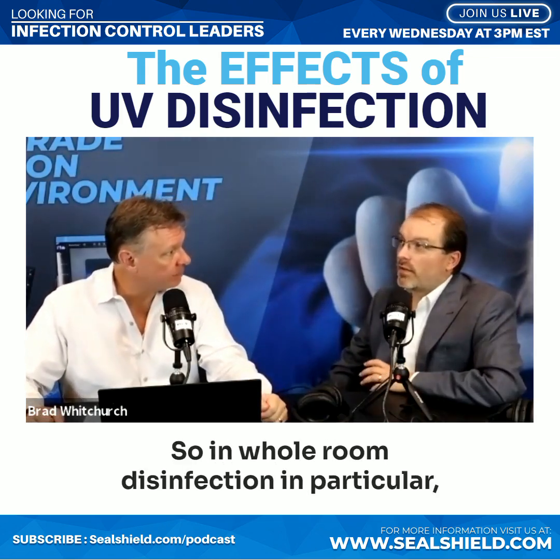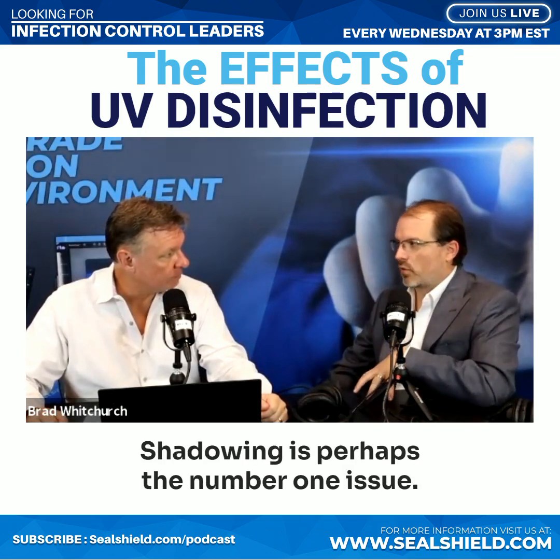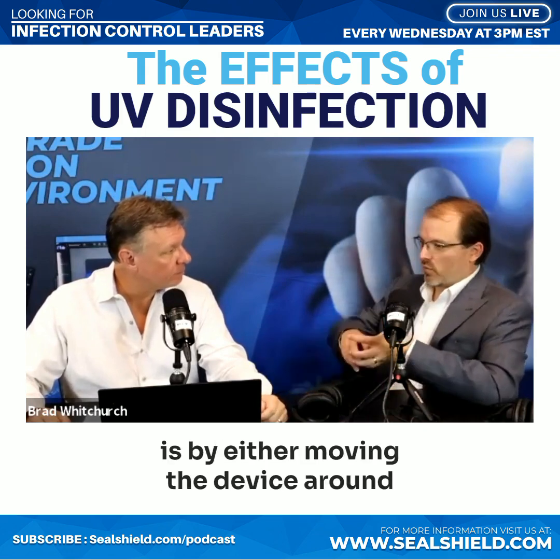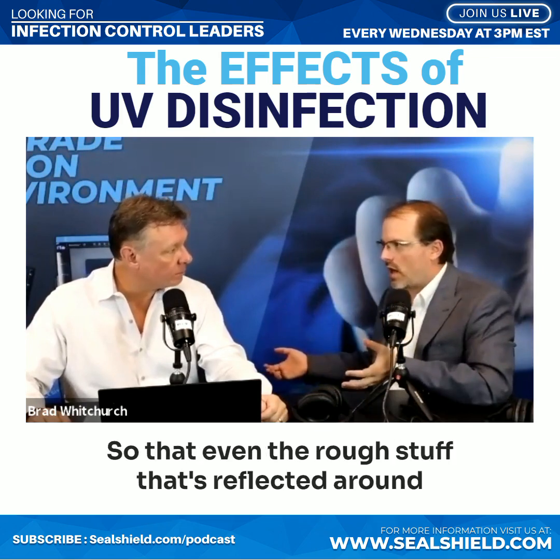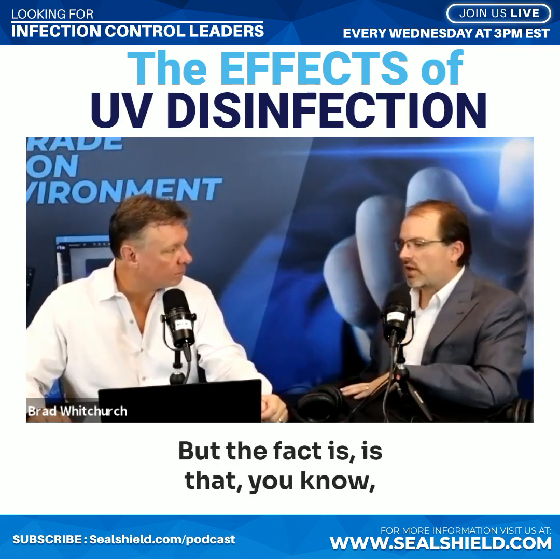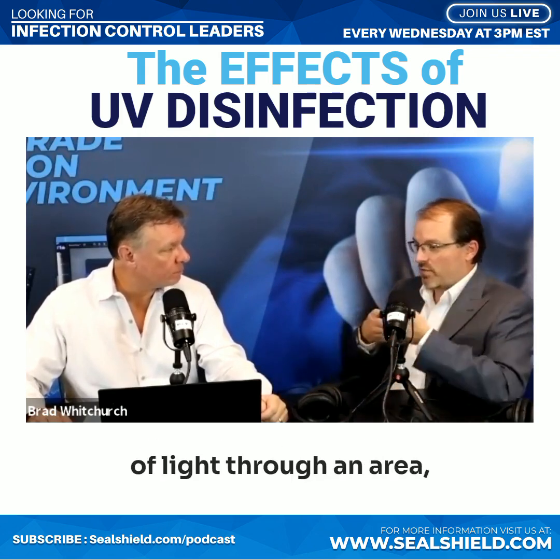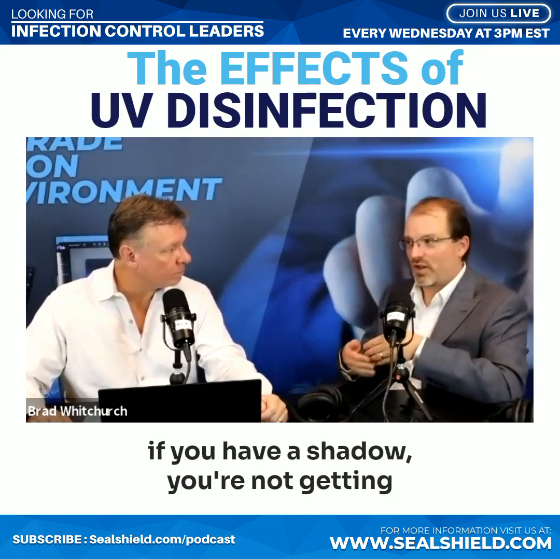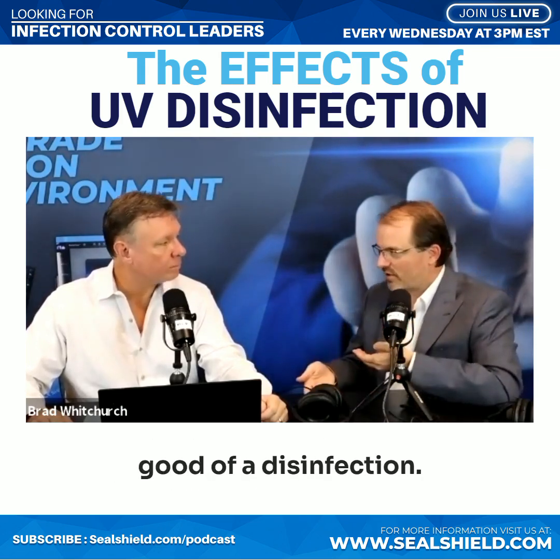Yeah, so in whole room disinfection in particular, shadowing is perhaps the number one issue. The way you try to mitigate that is by either moving the device around or perhaps emitting a ton of light so that even the stuff that's reflected around can still have an effect. But the fact is that if you have something blocking the transmission of light through an area, that results in a shadow. If you have a shadow, you're not getting as much light there. And that means you're not getting as good of a dose, which means you're not going to get as good of a disinfection.